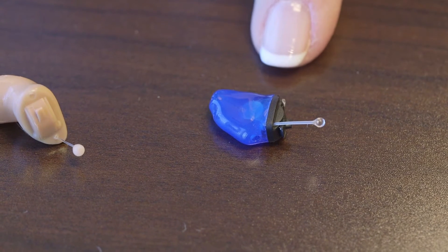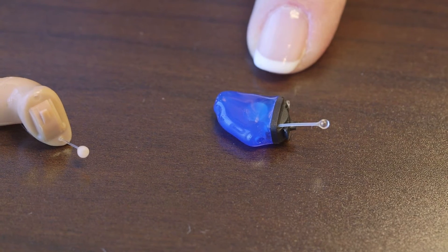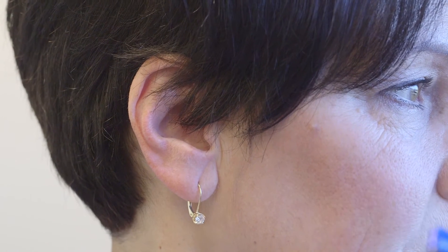Currently we also have something called a completely-in-the-ear-canal hearing aid that's even deeper, going very close to the eardrum. If I put this in, it will disappear completely.